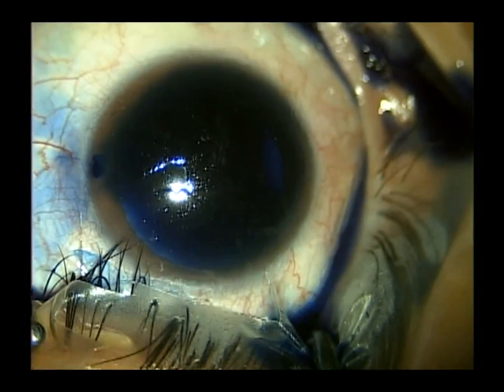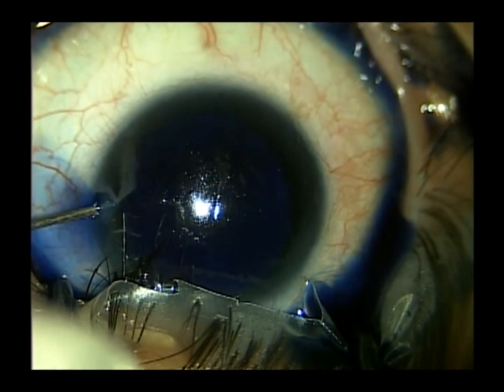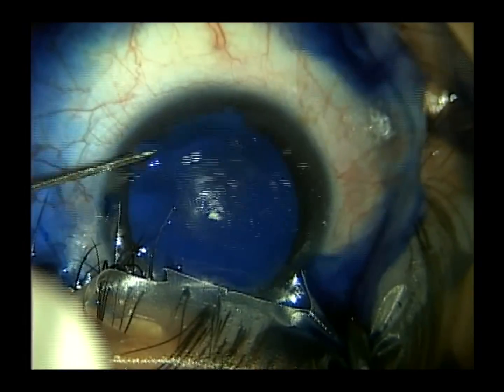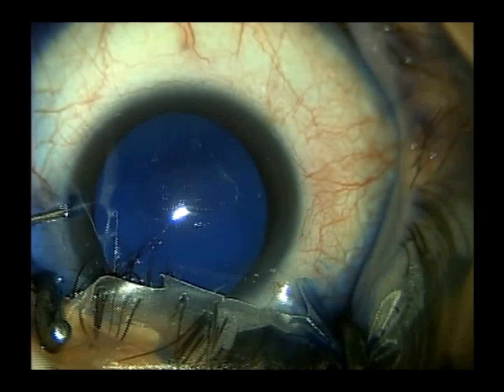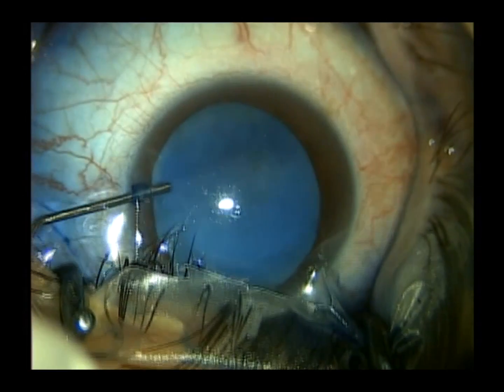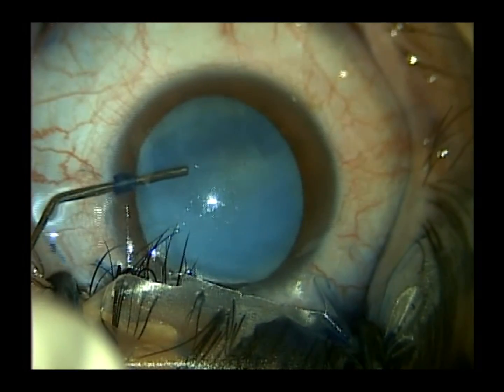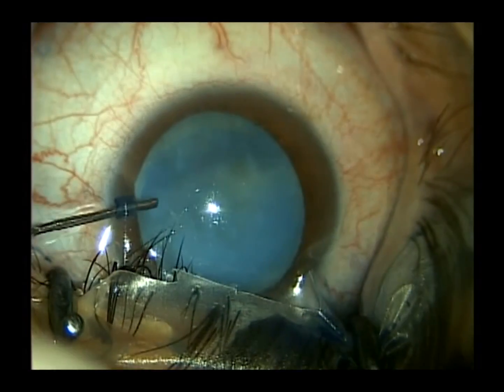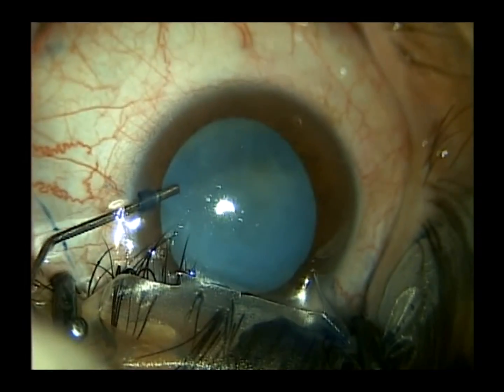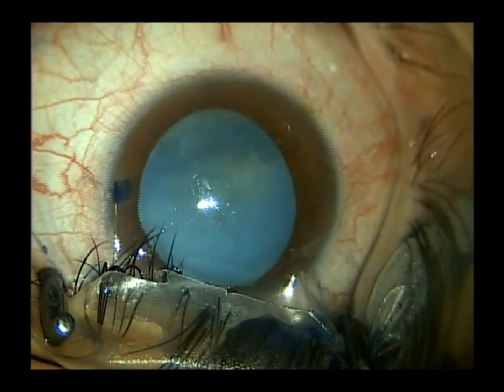The corneal endothelium remains very clear, and it's pretty interesting seeing the eye turn from blue to more normal. We wash away some of the mucoid residue off the corneal endothelium. At this point, we can see the anterior details very easily. We've made a very difficult situation very easy by using our friend, Vision Blue.